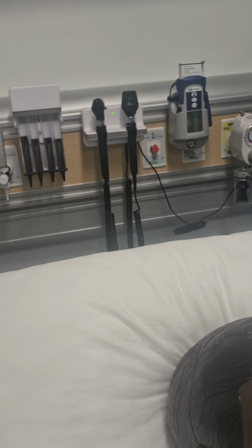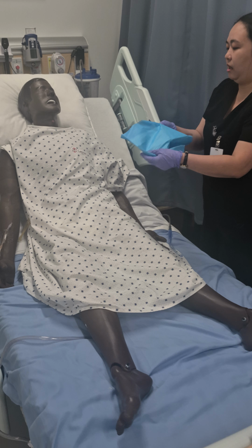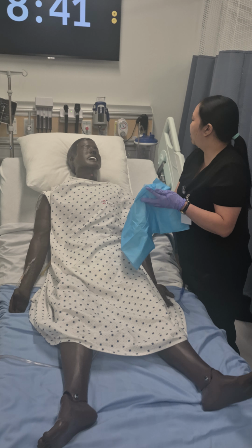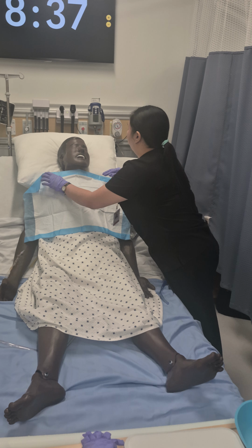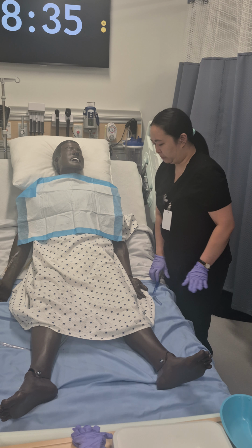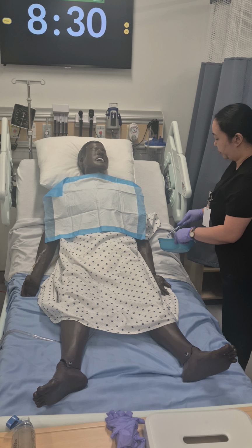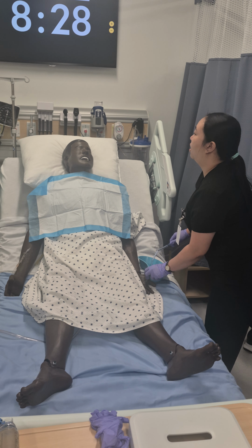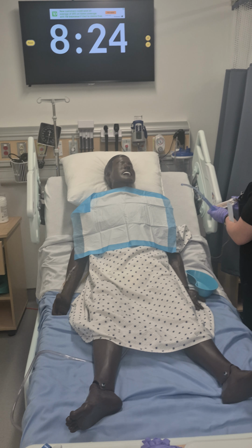And I already positioned my patient to high Fowler's position. And the rate of the wall suction is 80 to 120, but I put it at 100. So I'm just going to turn it on here. And then there's a solution for oral just to clear the Yankauer. And then I'm going to instruct my patient to open her mouth.